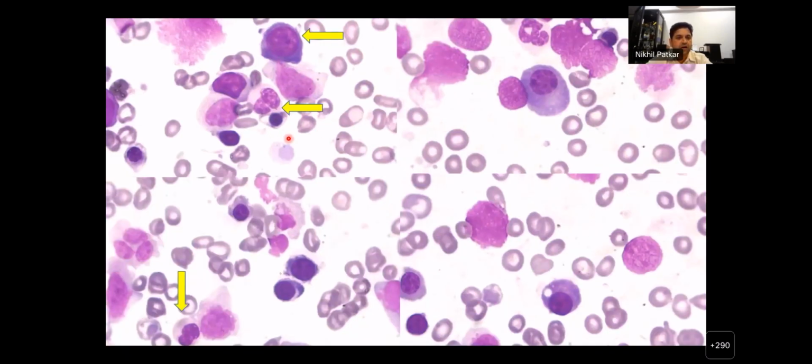Now, what is this cell at the pointer? Sir, a neutrophil. Yeah, a hypogranular neutrophil, almost pseudo-Pelger-Huet, but not completely because the lobes have different sizes. See this? What cell is this? Sir, an erythroid precursor, normoblast. What do you think is normal or abnormal? It can be an erythroblast because the cytoplasm is very scant. Yeah, it is a megaloblastoid erythroid maturation, almost like megaloblastic anemia, with that sieve-like chromatin.